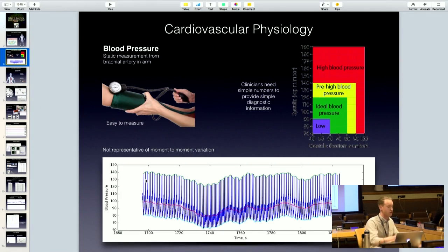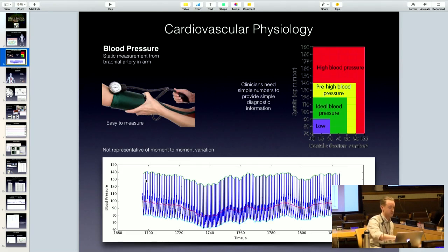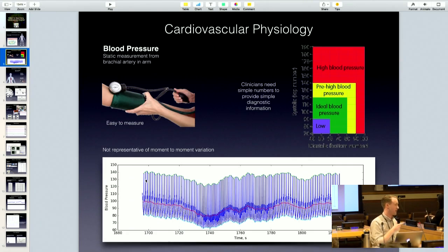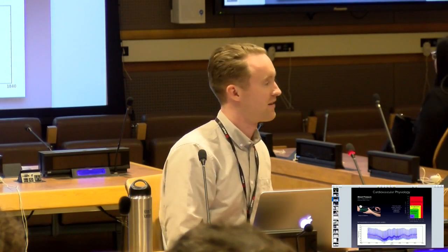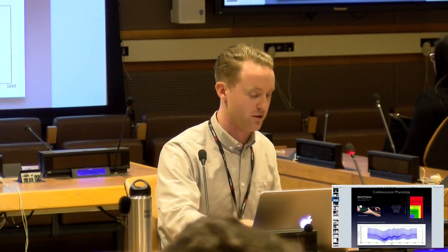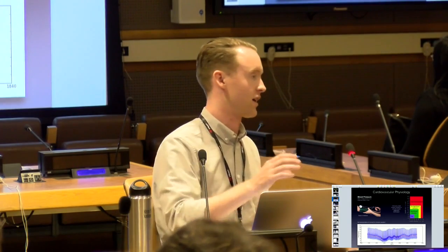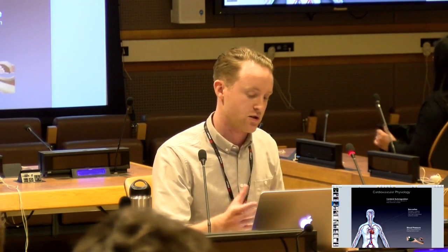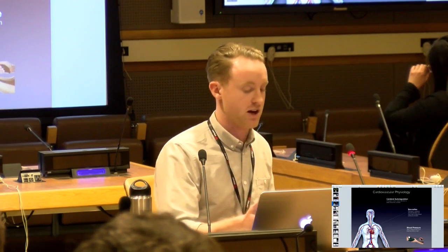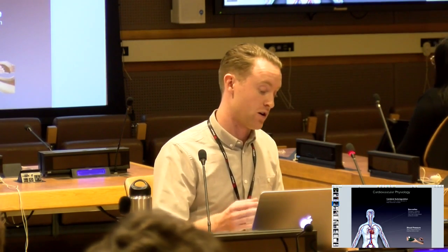This plot is a blood pressure plot showing a continuous waveform - I'll show close-ups of it later. We're so used to thinking of blood pressure as just a high and a low, but this is the continuous pulsatile flow recorded from a device on the finger that records at 1000 Hertz - so you're getting 1000 data points per second. The green, red, and light blue markers are all calculations I've done in Python that calculate the systolic, mean, and diastolic values.